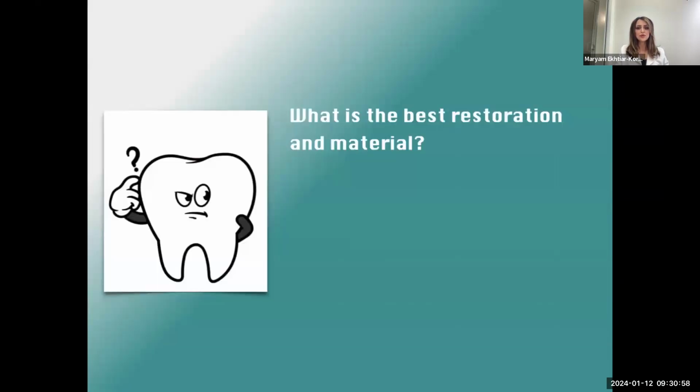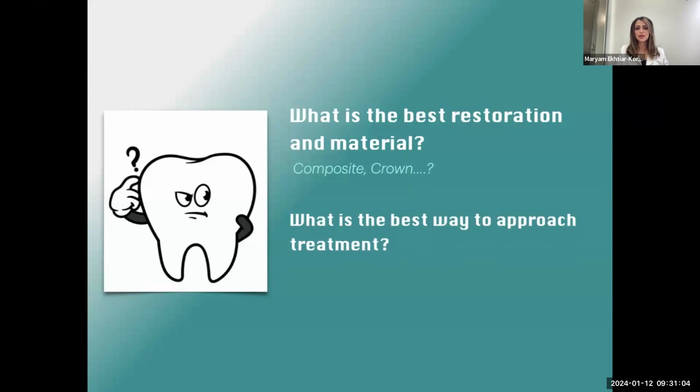So I ask you, what is the best restoration and material? A composite or a crown? And what is the best way to approach treatment? Would you approach it with a PVS impression or with a CAD/CAM digital scanner and possibly an in-office mill?